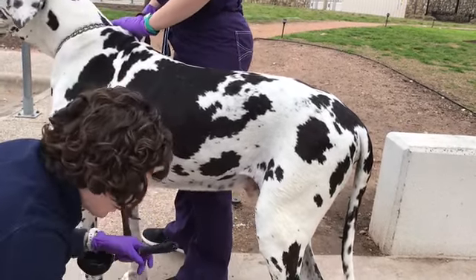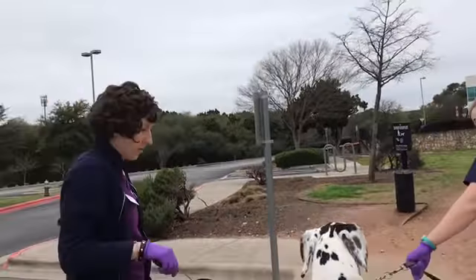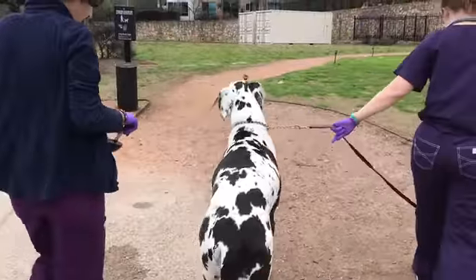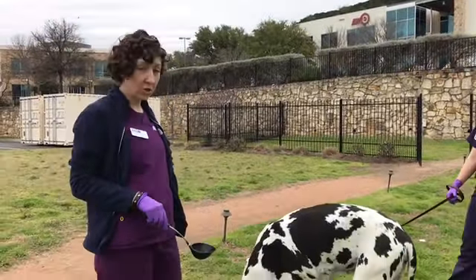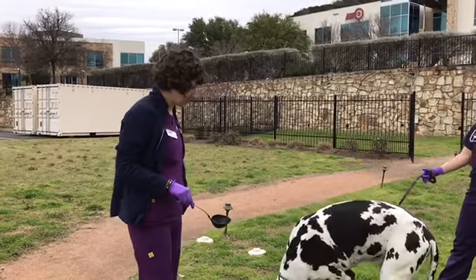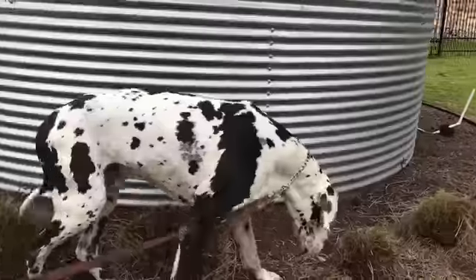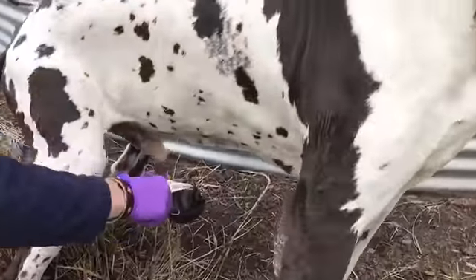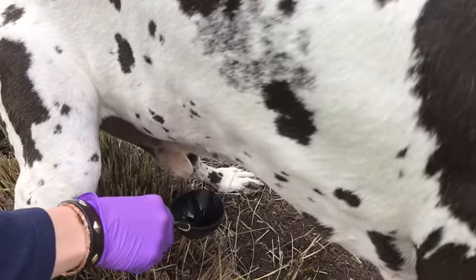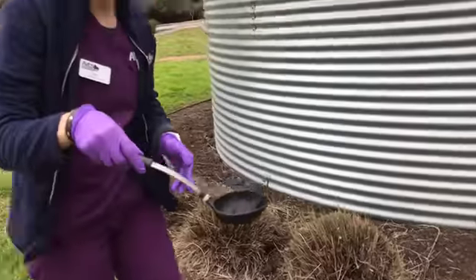Okay, I've got my ladle, and now we're going to get the free catch. We want to get it midstream to try to help eliminate whatever bacteria is on the prepuce. Okay, so we want to get it midstream. Good boy, George. And that is how you get a free catch urine sample.